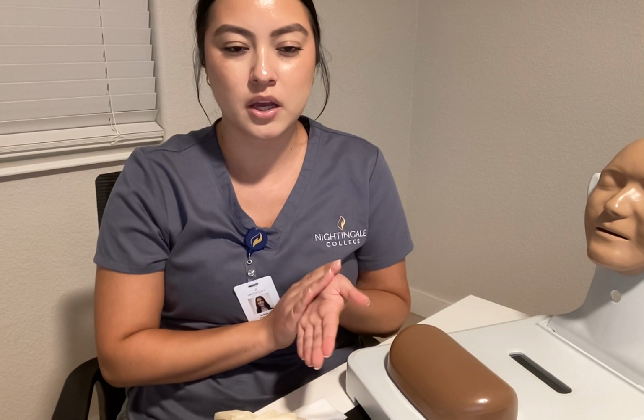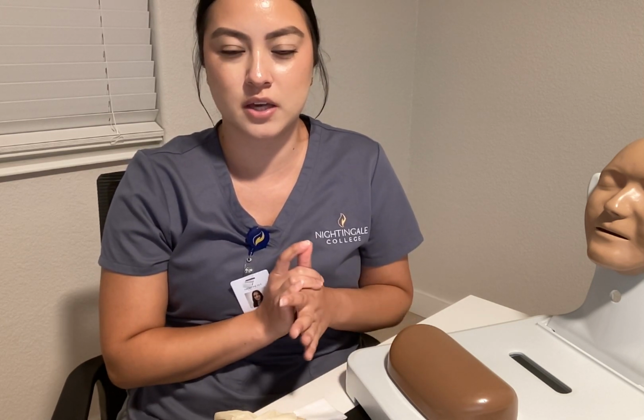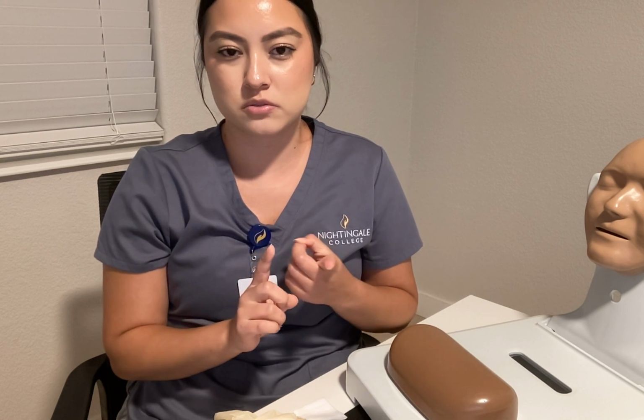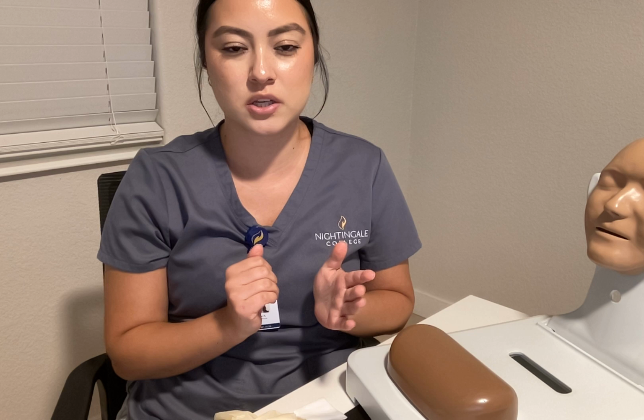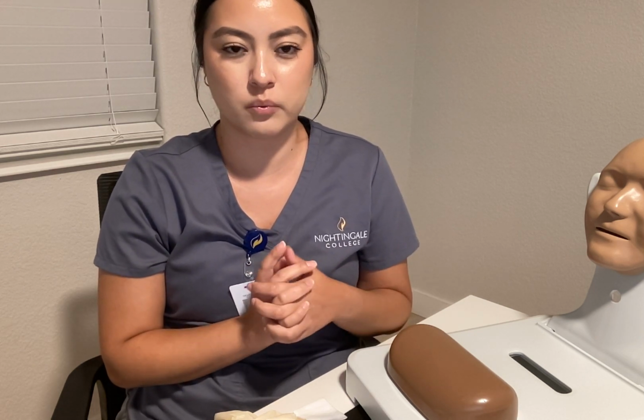Before we get started, we want to go ahead and verify the 6 rights of medication administration, which is right patient, right drug, right route, right dose, right time, and documentation. For today's injection, we're going to be giving heparin, which is 1,000 units subcutaneous, just 1 dose.